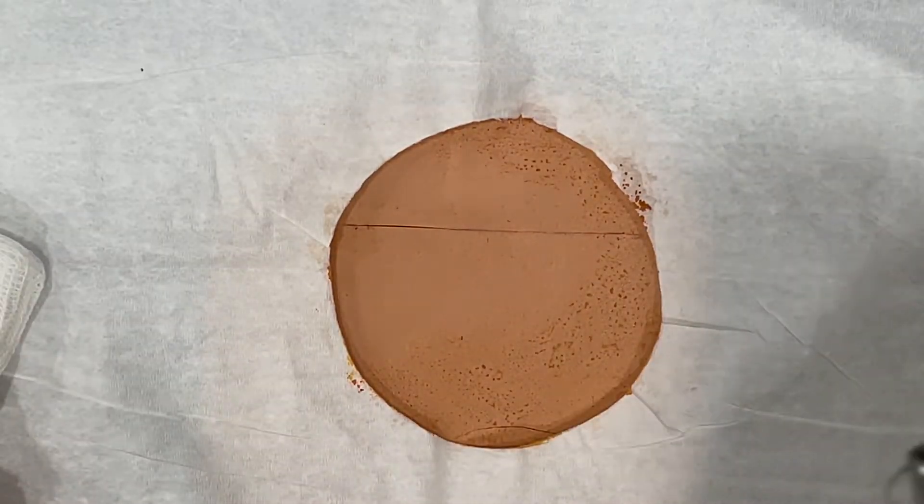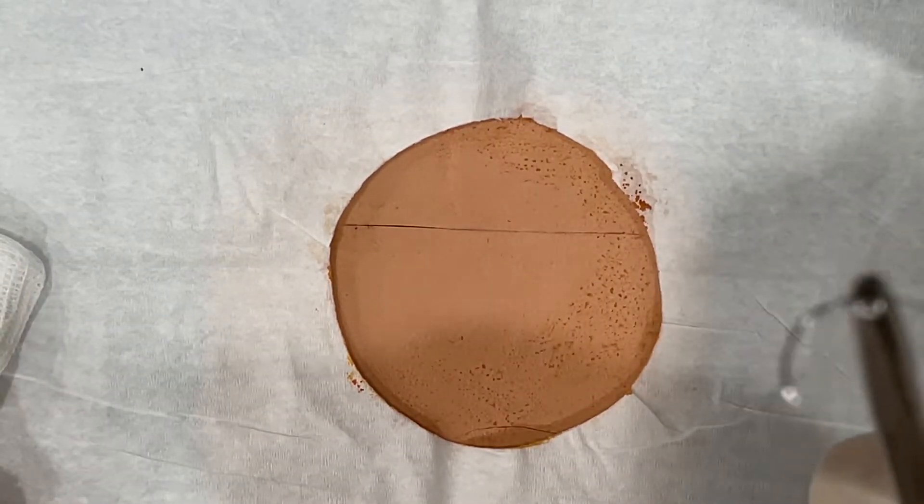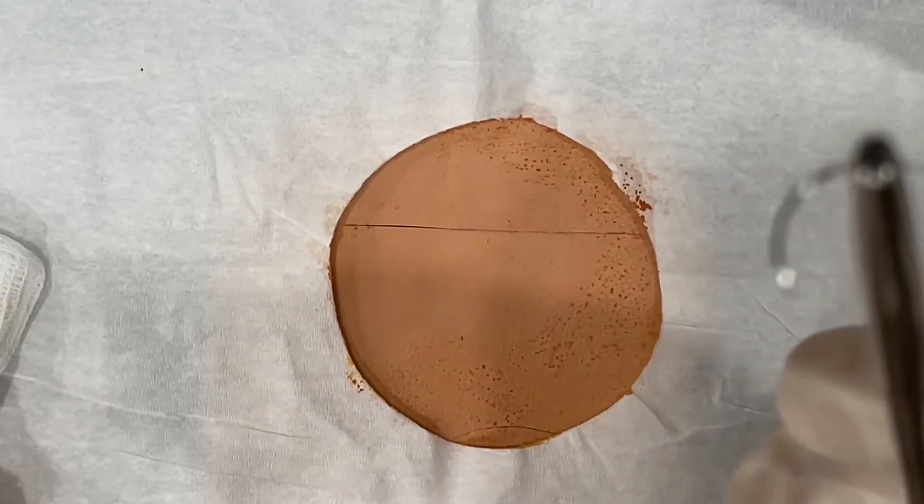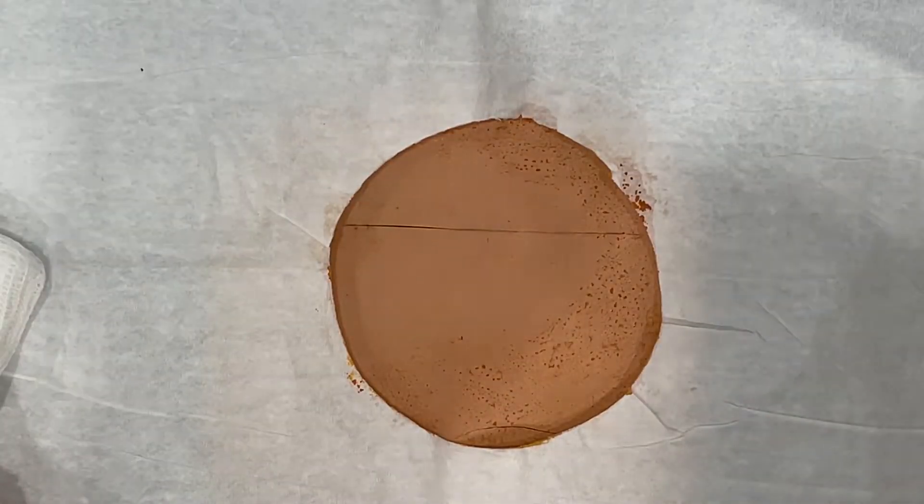First, I want to show you how we load the needle. Load the needle at the top third of the curved needle.